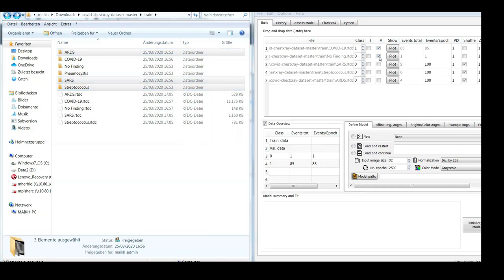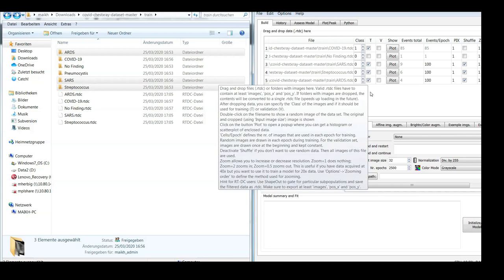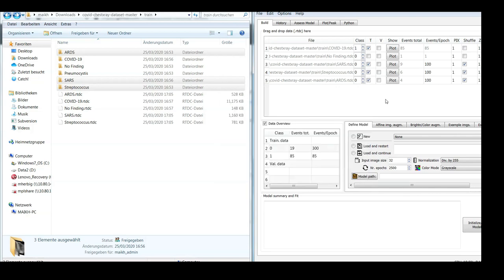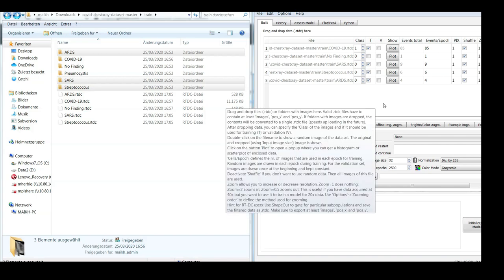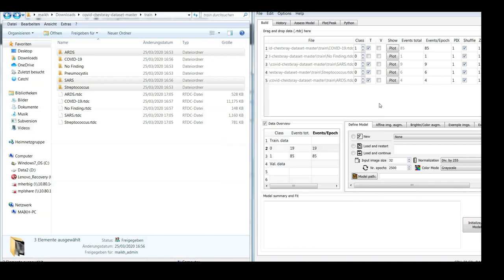So I now still need to load the corresponding data. So as I said, I don't want to use Pneumocystis or 'no finding.' These are used for training. So let's say COVID-19 is now class 1, while SARS and Streptococcus and ARDS is class 0. We can now see that in class 0 we have 19 images in total. So in order to create a class balance, I would like to use 19 random images from COVID-19 in each training iteration.